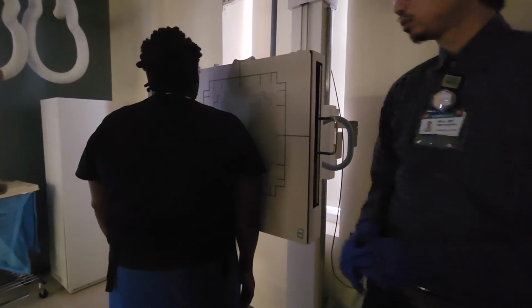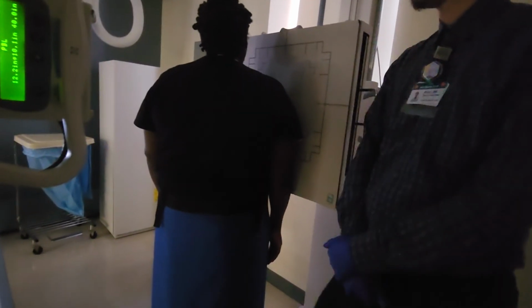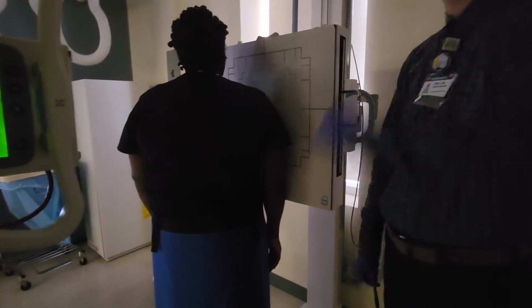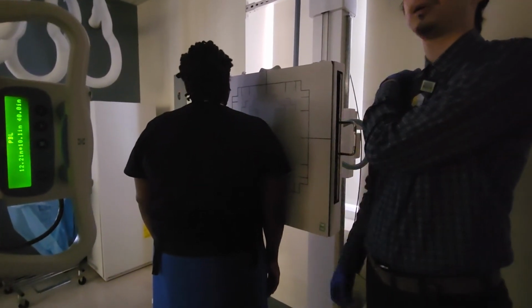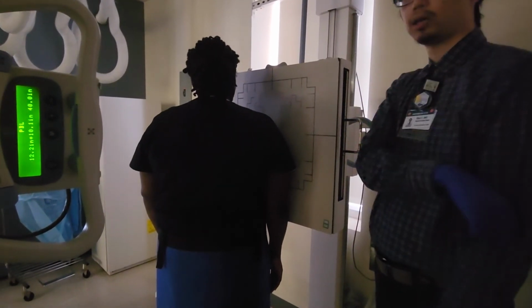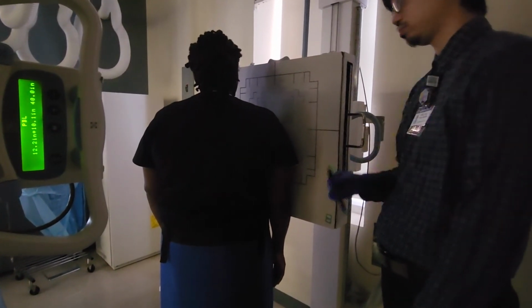For the arm position, notice that I have the arm just hanging straight down. Why do you think the arm hangs straight down on this Y view of the shoulder? Because it's trauma, that's right. If it's trauma, I don't want to be moving my arm around everywhere. You will see techs ask patients to bring your hand up to the opposite shoulder. I don't like that, because if there's really trauma here, this is not something you want the patient to do. So just for a Y view, leave the arm hanging straight down. It also makes it easier to check for dislocation.